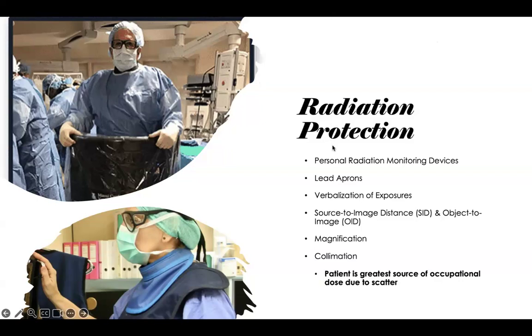Okay, got a couple of answers. So three things, you guys are on the right track. Three things that are affected or increased when we use magnification: we increase the contrast, increase spatial resolution, but we also increase patient dose. So we have to be mindful of using the magnification mode on the fluoroscopy machine or the C-arm.